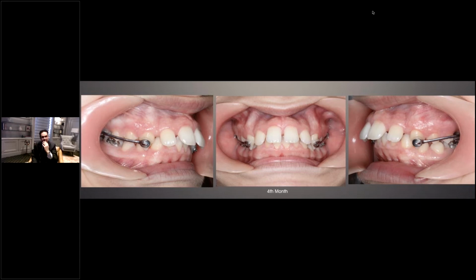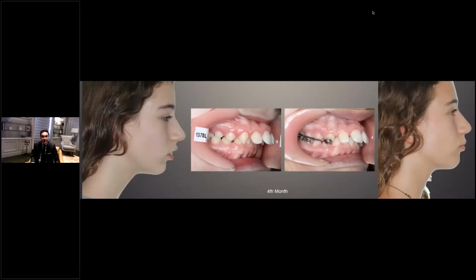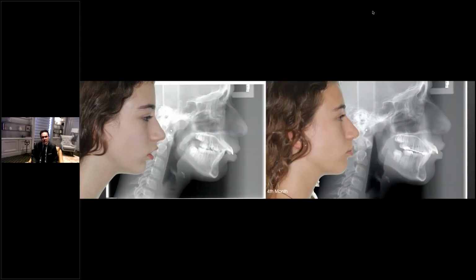This is very interesting, because here, this 14 millimeter overjet has been massively decreased. And this approach, in which we have been able to decrease this overjet, will help us very much in establishing a better position of the mandible, because now the mandible is establishing a nicer relation. Here we have the patient who has not yet been treated on the incisors, but we can see that this mandible is establishing a completely different scenario than the patient had at the beginning of the treatment. So this is our objective, to bring this relation into the natural position.